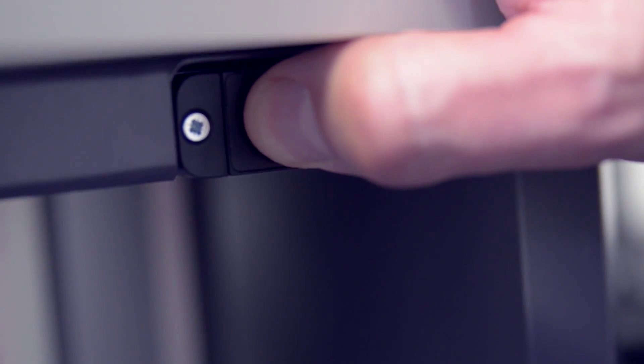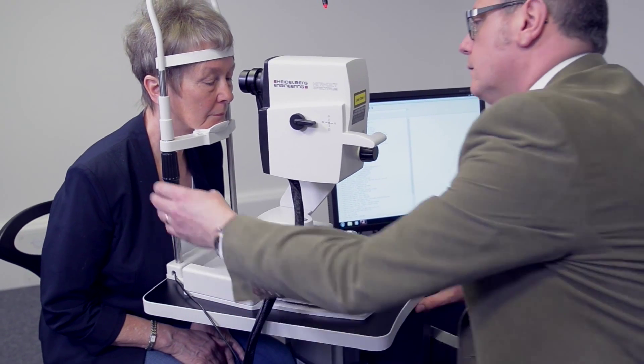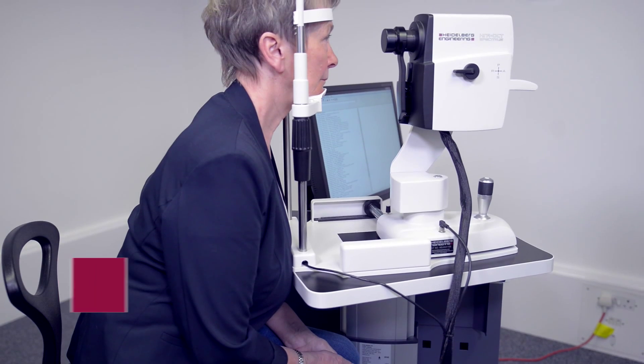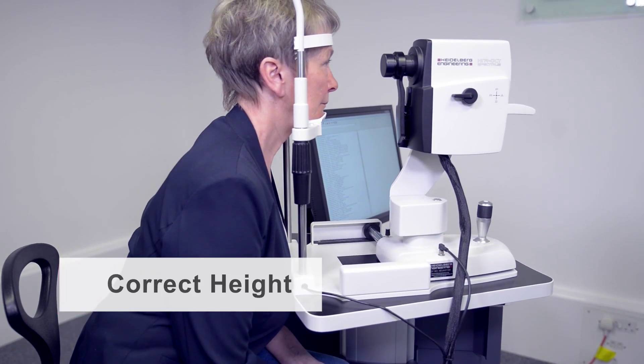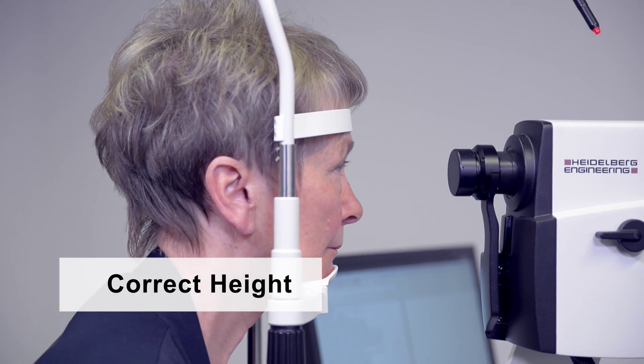Adjust the table and chin rest height so that the patient is comfortable, aligning the outer canthus of the eye to the mark on the headrest. The patient is correctly positioned when their head is firmly against the forehead rest and the chin is in the cup.